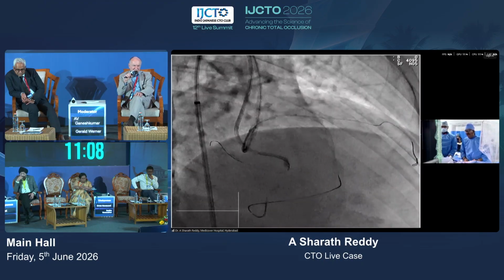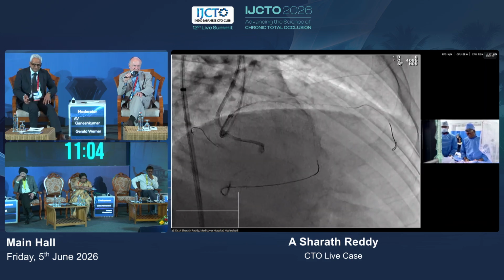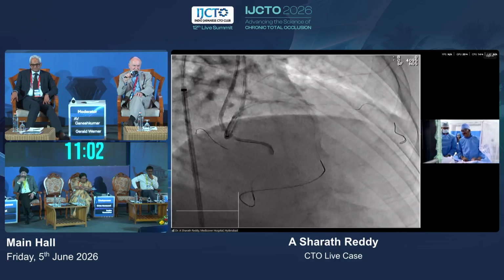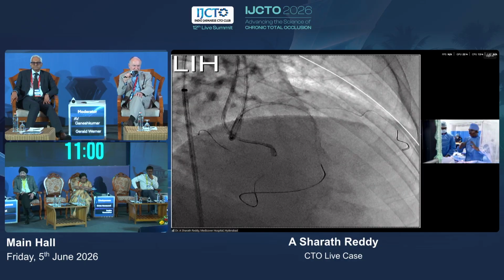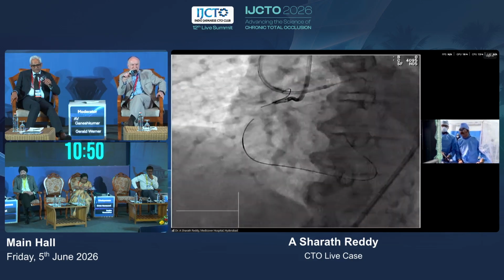So your wire advanced. No, but that is just going into the other branch, the side branch. Okay. So just go to LAO, right? So what I'll do is I'll just take the balloon a little back, or the microcatheter a little up, Sharath, down. We have Dr. Yamane to comment.